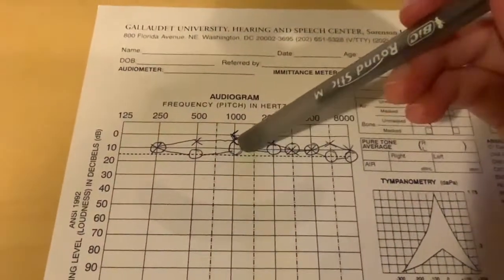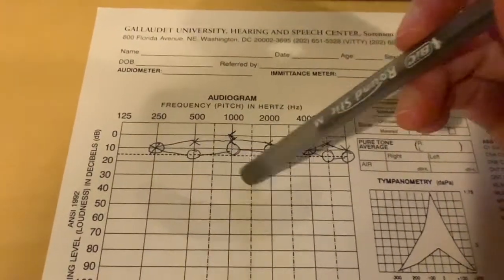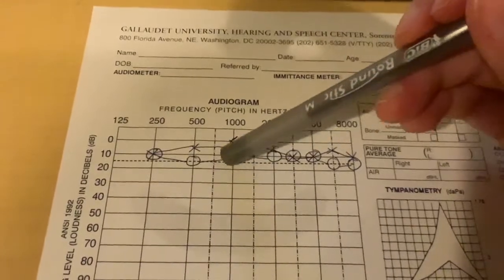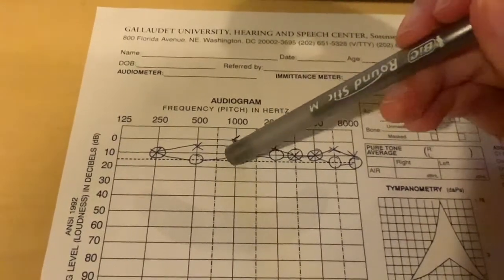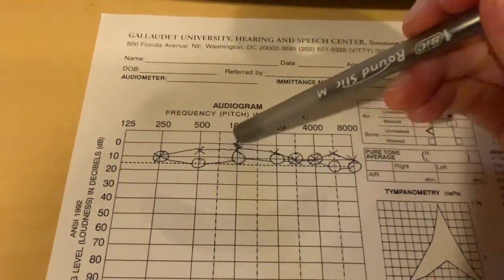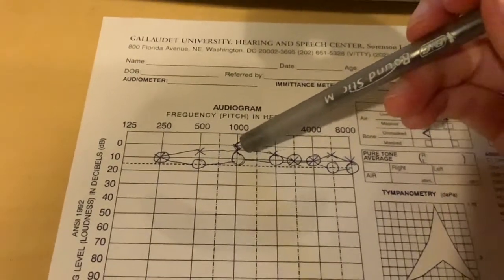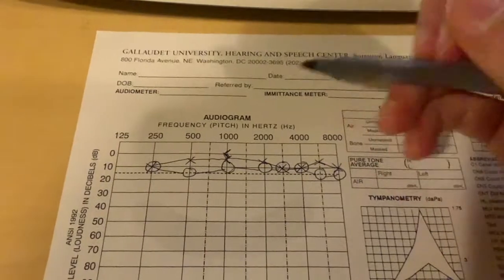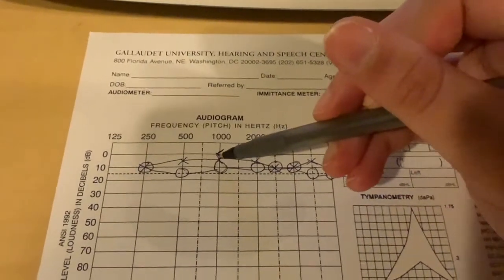And ideally you would use different colors for these so you can tell them apart. It looks kind of messy here, but as we remember, we have the circle for the right ear threshold, an X for the left ear threshold. And then on top of that, we have that threshold, the unmasked bone.